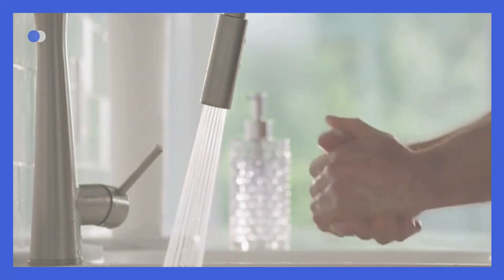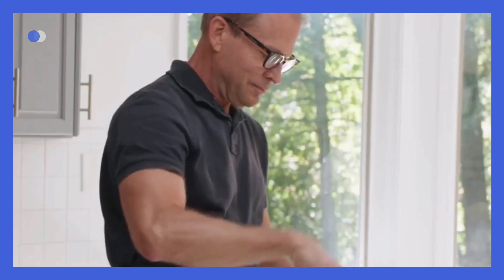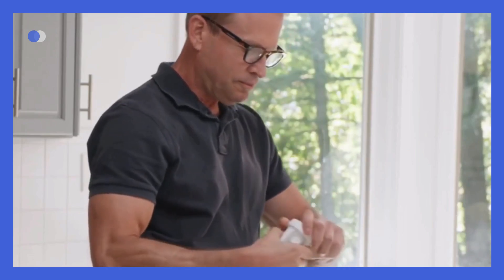Before you begin, wash and dry your hands. Clean your site with an alcohol wipe and let it air dry for at least 10 seconds. Then get your applicator and unscrew the cap.